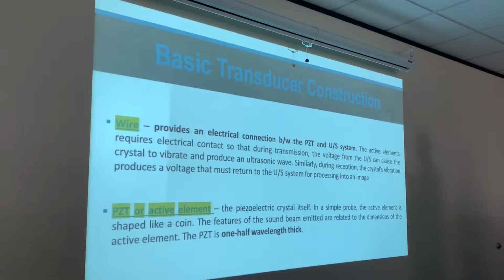But for explanation purposes, that's why they have it labeled this way. Okay? So the features of the sound beam emitted are related to the dimensions of the active element, meaning that the shape of the PZT changes the sound beam, or the characteristics of the sound beam.